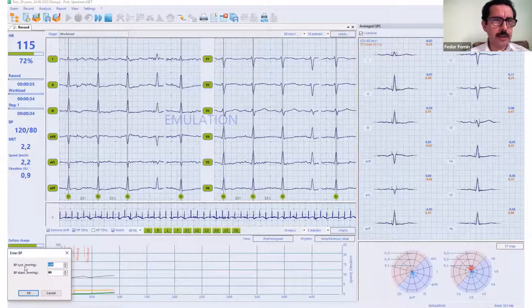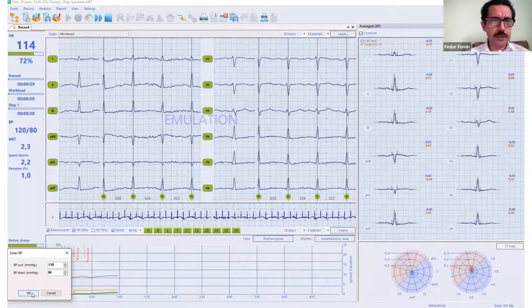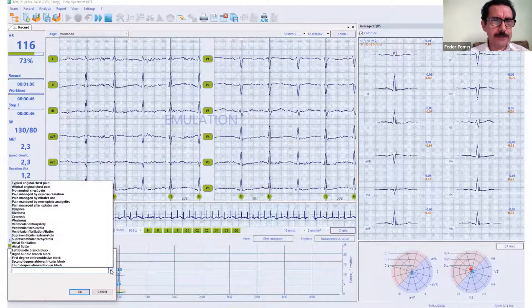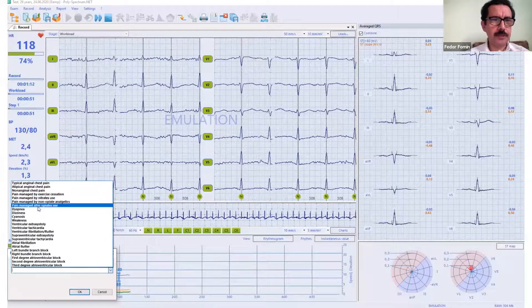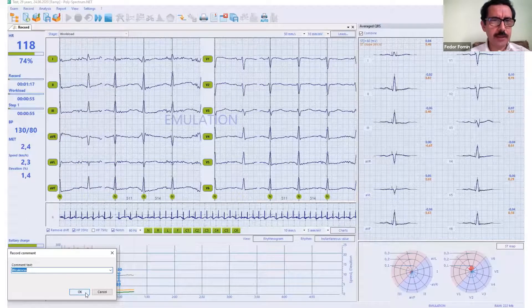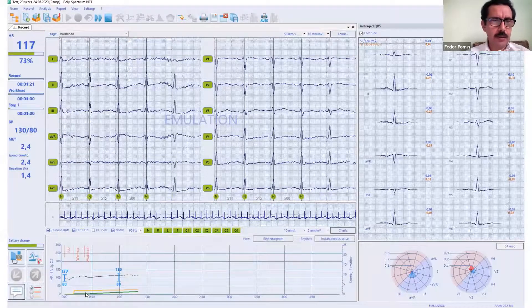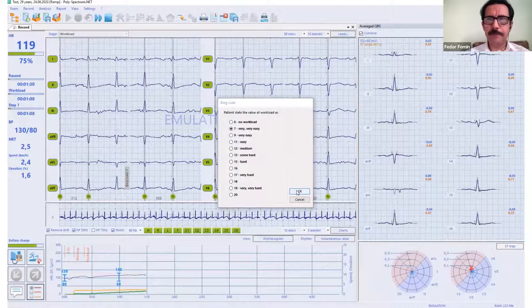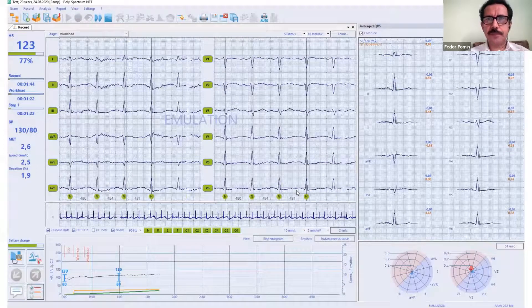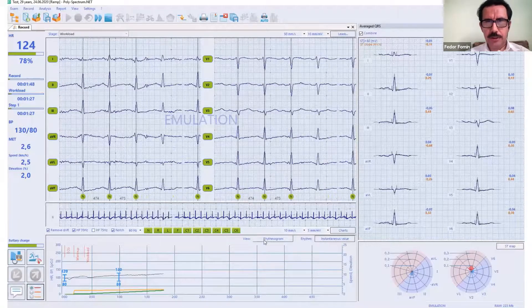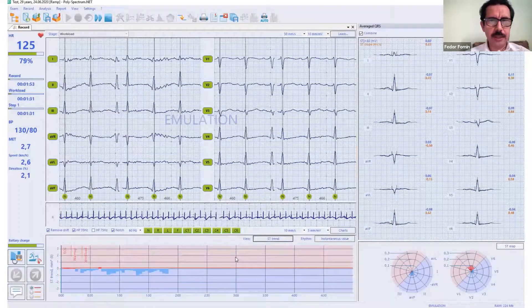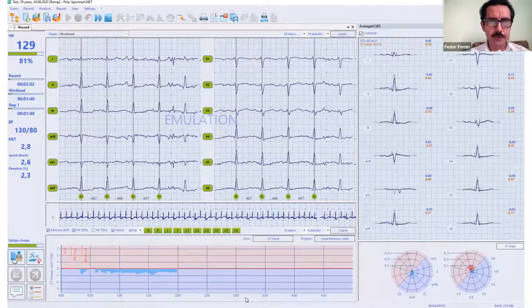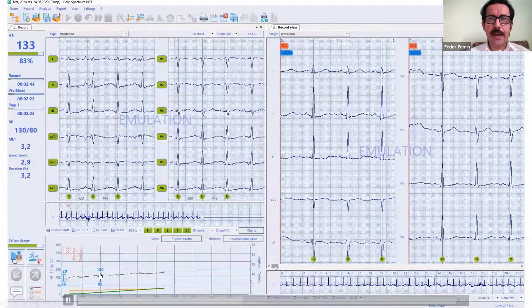During the exercise, I can input blood pressure data manually from the measurement, or start automatic measurement if a supported device is connected. I can also use comments from a dictionary — standard phrases to be fast — or input any text I want. I can also input the Borg scale, asking a person how it feels. ST segment data is visible here as well. Ischemia detection and ST segment analysis is one of the main reasons for most clinicians to perform this exercise stress test.